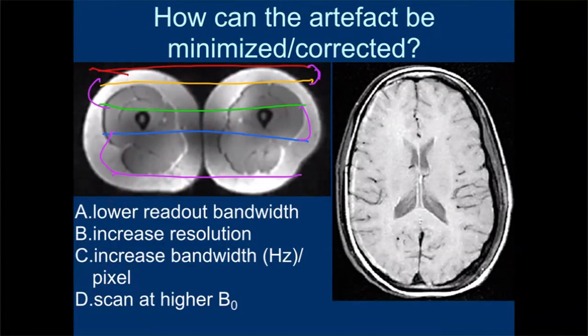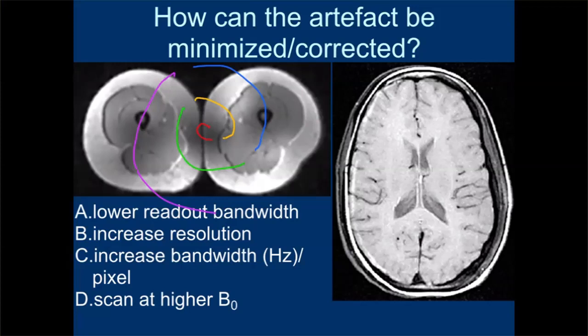And if we're talking about spirals, it would be red, orange, yellow, green, blue, purple, right? So it accumulates that way. And so the result is a phase that varies radially. And that's why it causes a blur, because the inverse Fourier transform of a phase that's radially distributed is like a spread function, it's very spread. Does that make sense? No? Any questions?